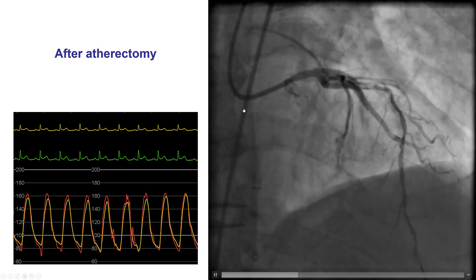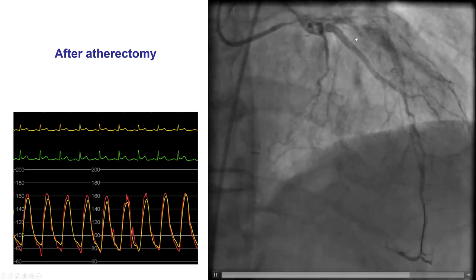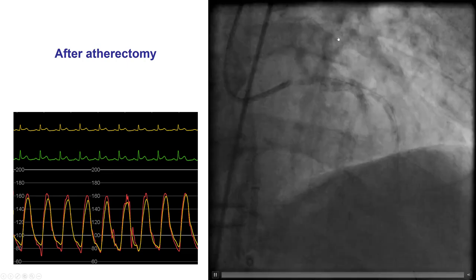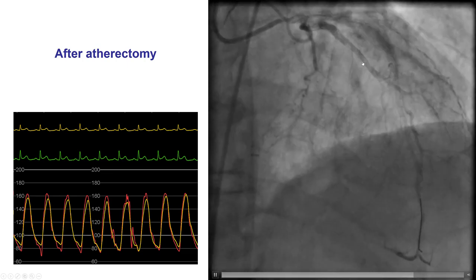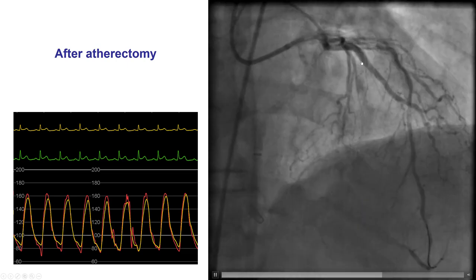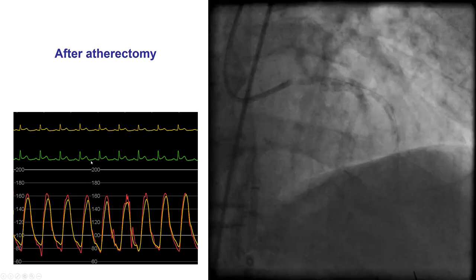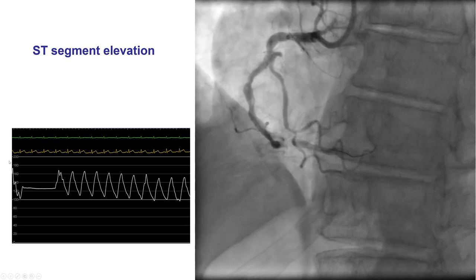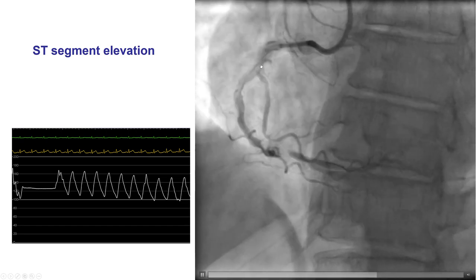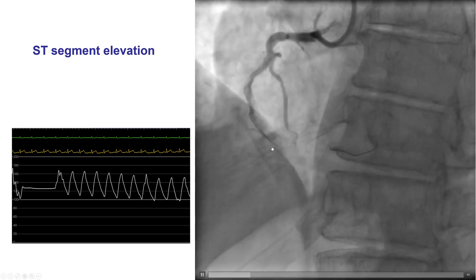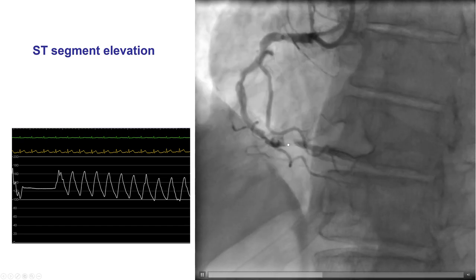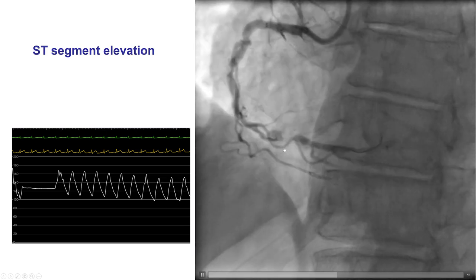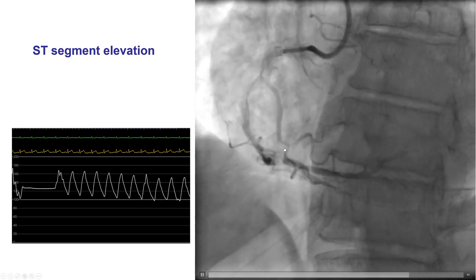This is an example of dissection after atherectomy of a heavily calcified LAD. There is a hazy filling defect in the LAD, and there is also ST segment elevation on the EKG. This is another example: a patient who had atherectomy of a calcified right coronary artery, with a dissection in the distal right coronary artery that resolved after placing stents.